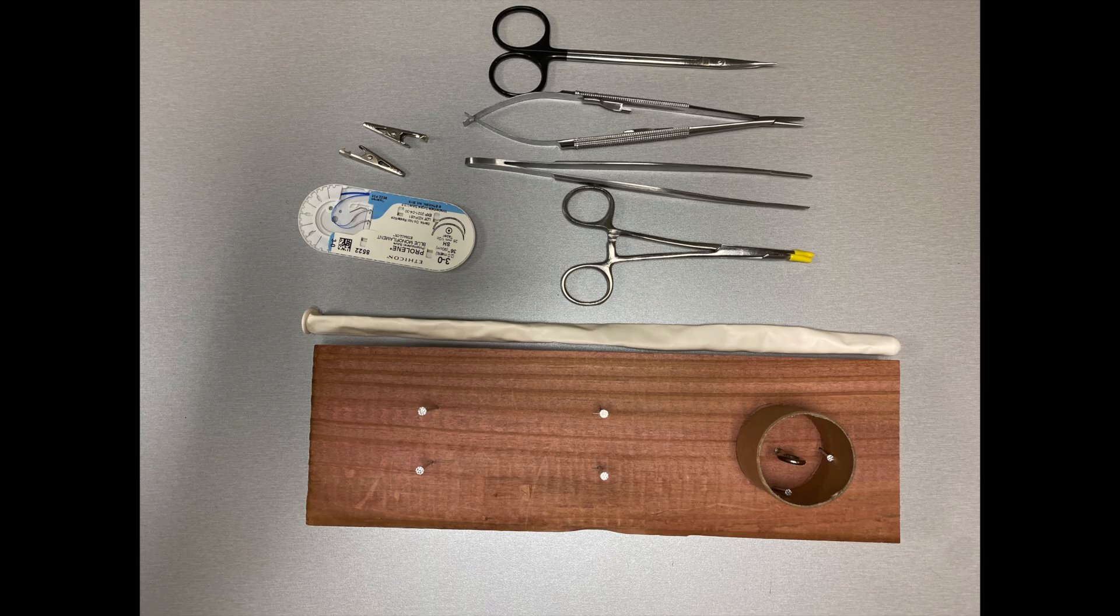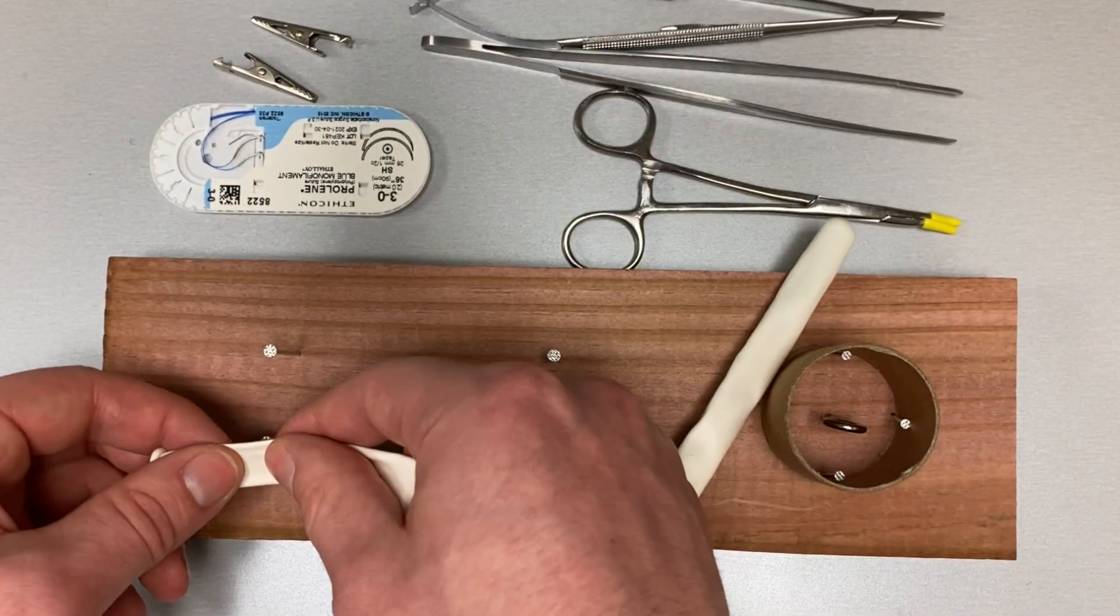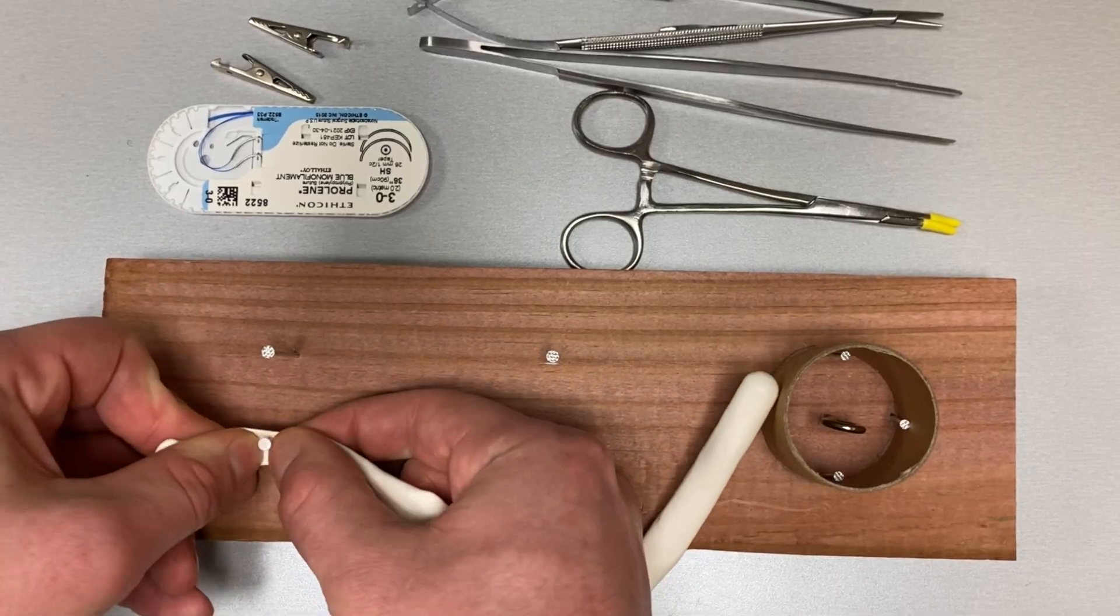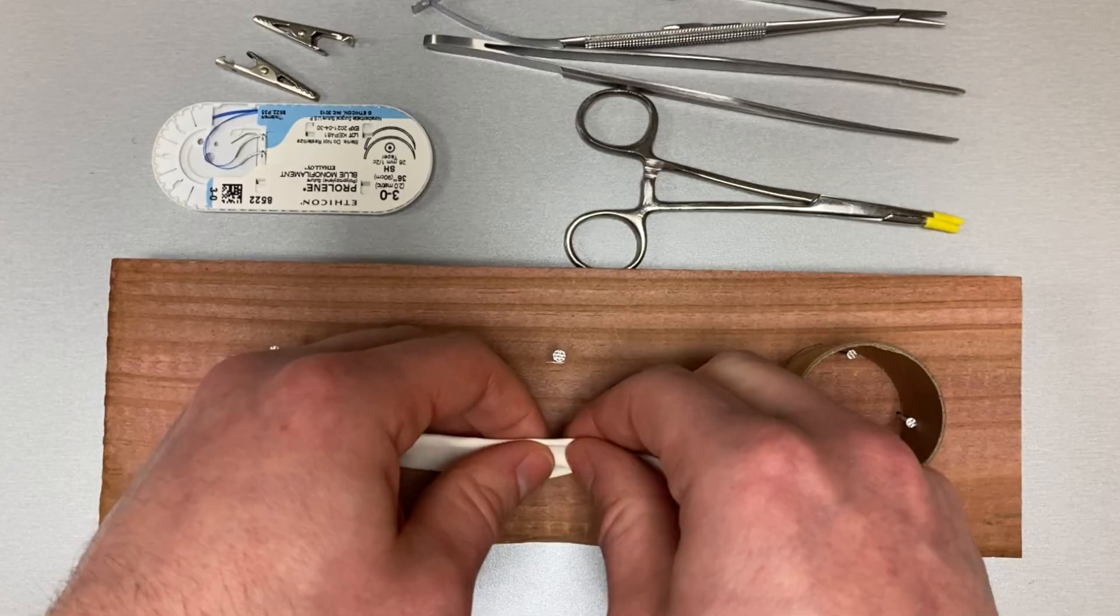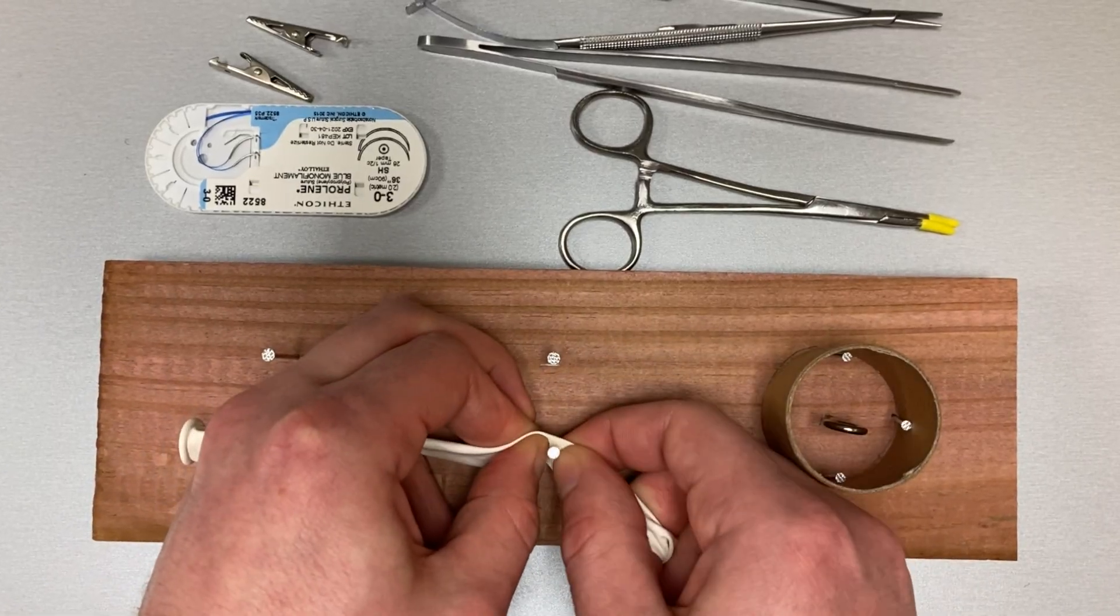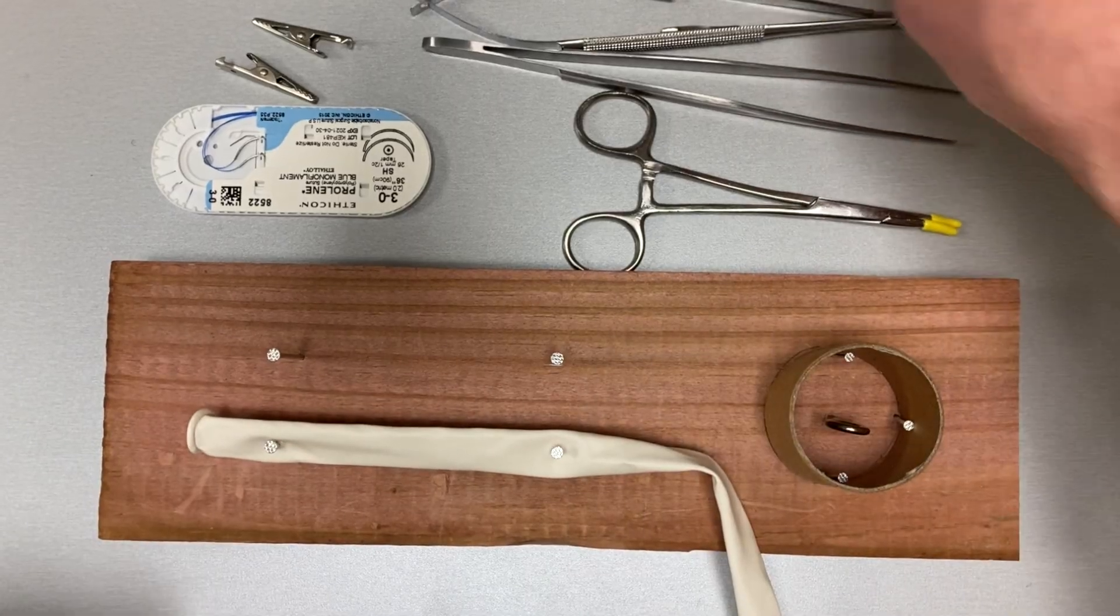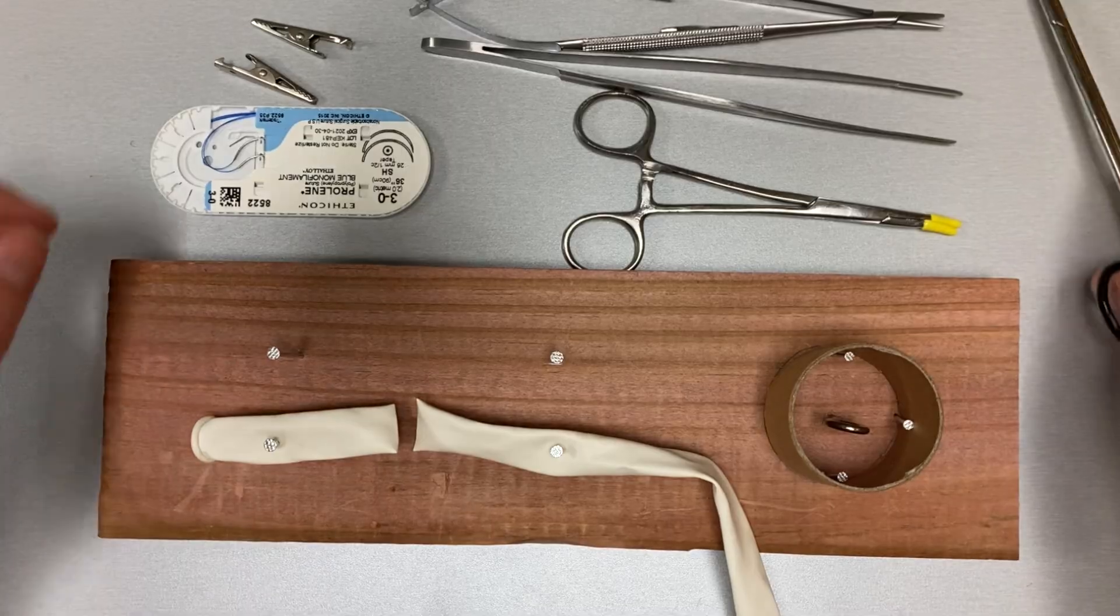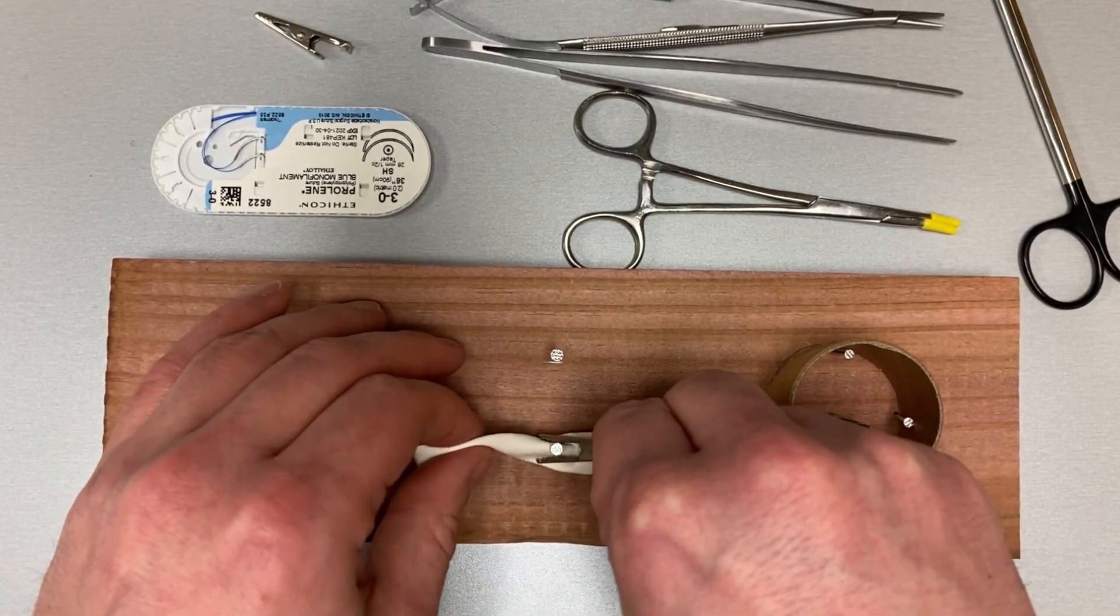Here are the materials required for the end-to-end vascular anastomosis module. First, place the linear balloon on the nails. Use your scissors to cut the balloon in the middle, then use the alligator clips to secure the balloon.